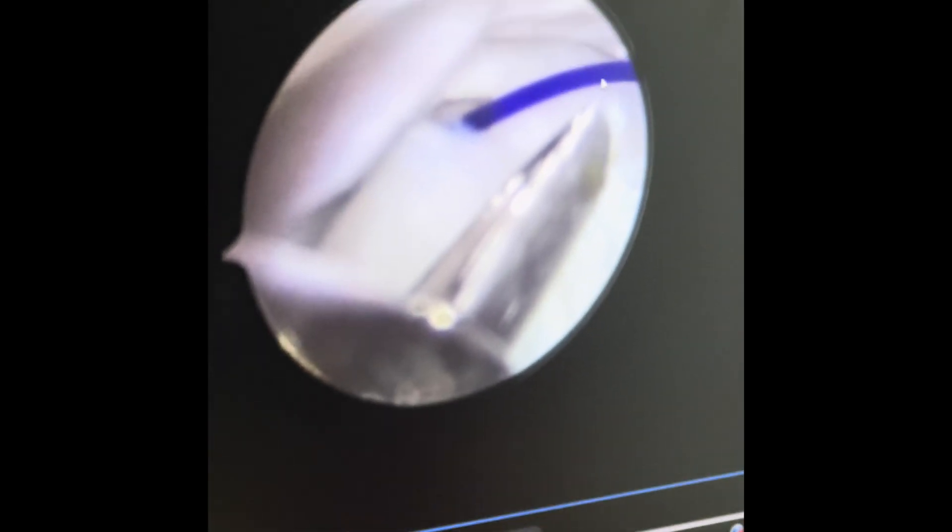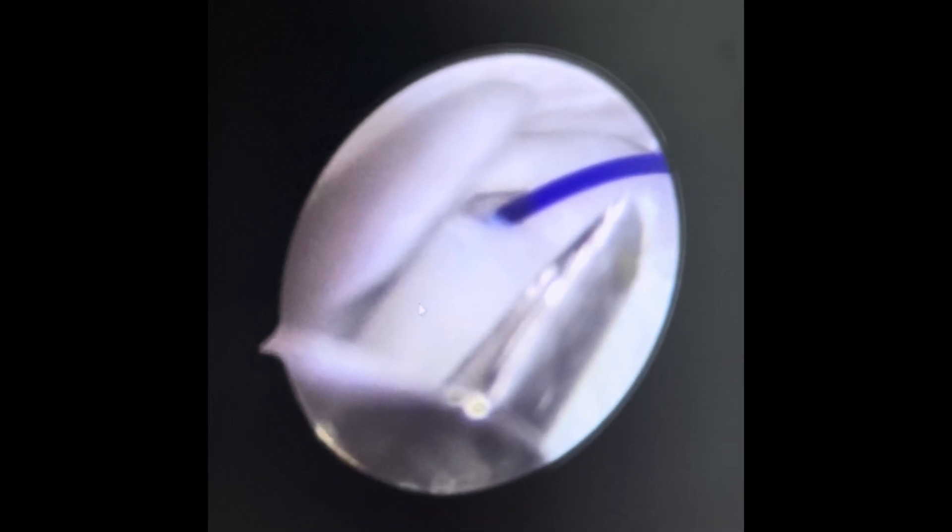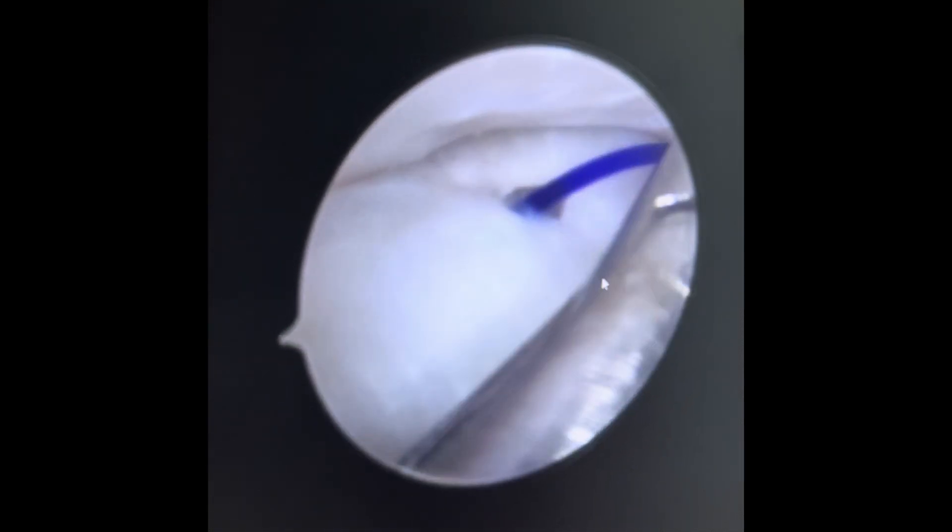This is the stage where I retrieve the suture. You can see it has been passed through the needle; the needle is slightly withdrawn and the suture is passed through. The graspers come through the port — this instrument is under two millimeters in diameter so it's very magnified — and I grasp the suture and withdraw it back through the port. The suture now runs through the skin, through the capsule, through the disc, and back out close to where it went in. I can hold the suture from outside and demonstrate that I can pull the disc backwards and outwards using the suture.